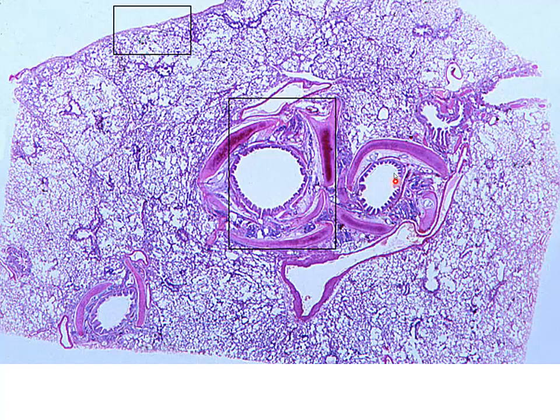Here we have a bronchus. Here we have one, we can still see the cartilage. So this is also going to be a smaller, but still an intrapulmonary bronchus.